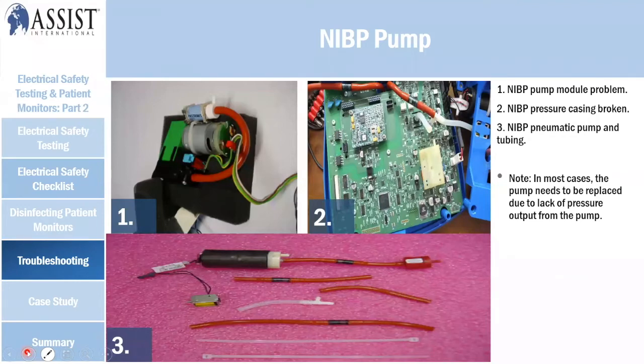So in most cases, you're going to see the pump needs to be replaced due to the lack of pressure output from the pump itself, because the membrane inside the pump may have failed, so it doesn't push enough pressure.